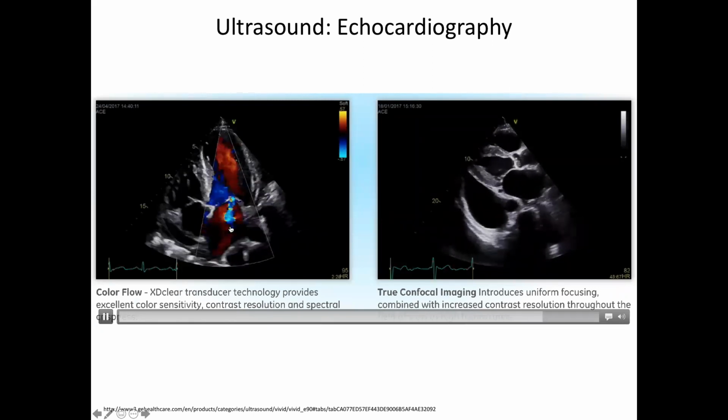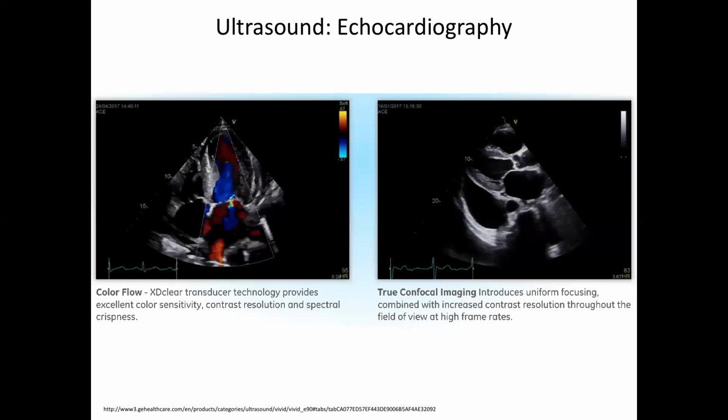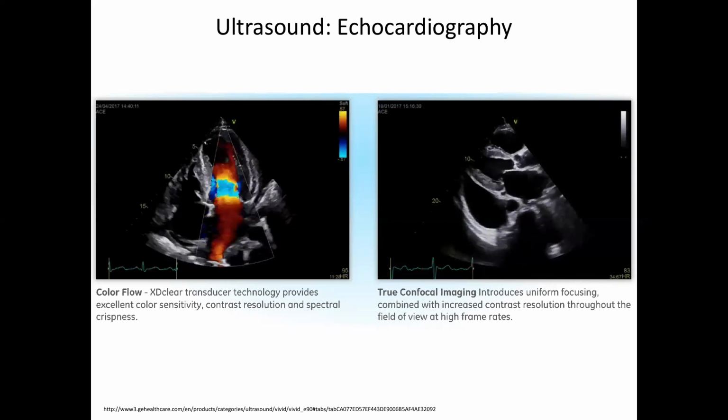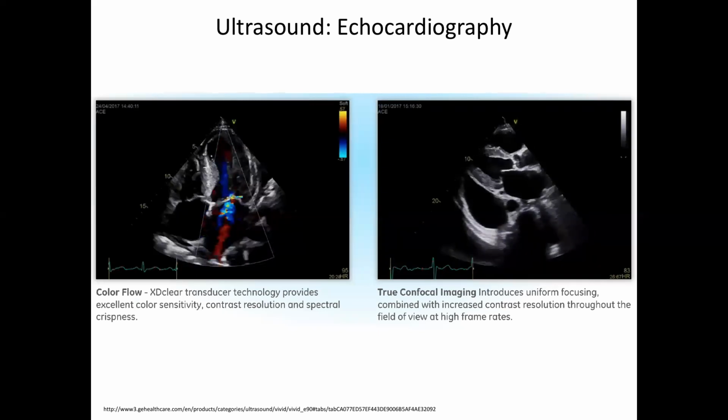frequency of the signal that's reflected back to your transducer. And if the frequency is shifted up when the signal comes back. So what happens, we'll see, is you put out a set of pings, just like bats with echolocation, they put out little chirps. This machine puts out a little chirp, you know, maybe 2,000 chirps a second. And that chirp goes into the sample and then reflects back off each thing that can make a reflection. So you listen to those reflected chirps, and they're usually, you know, thousandths the amplitude of what went out.